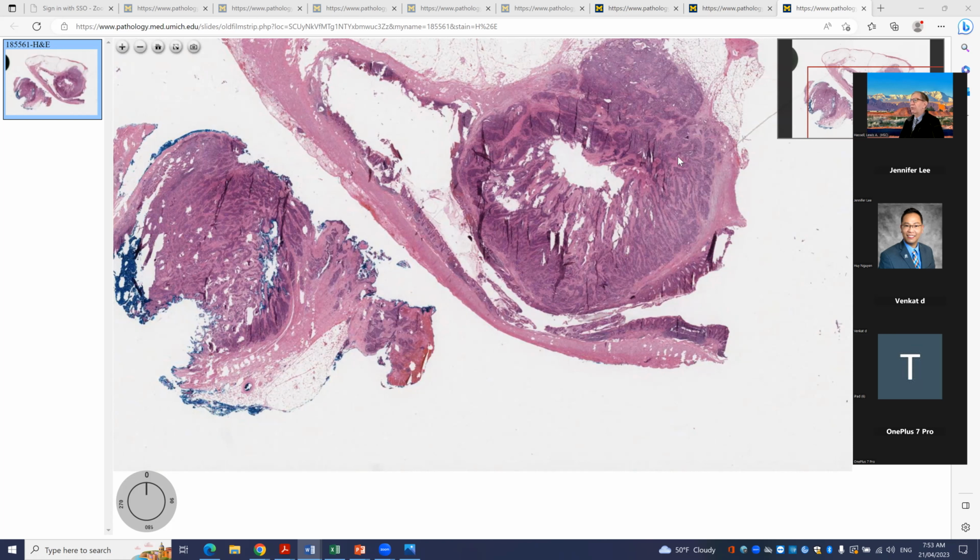And then P53 that is mutated, either showing overexpression or loss of expression. Those findings together make for a pretty strong case for serous carcinoma arising from the gynecologic tract, and you can pretty well rule out most of the other entities with those findings.